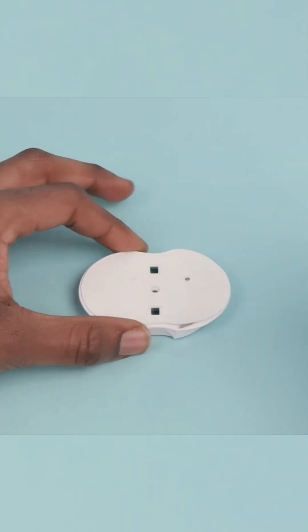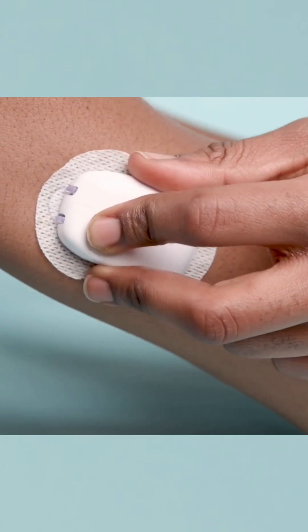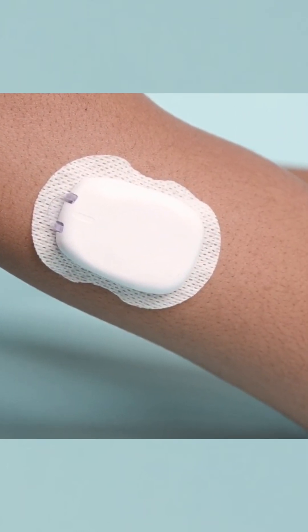When you lift it up, the adhesive is already exposed and peeled off — it's ready to go. So you lift it up and put it on. Fill. Attach. Apply. It's really simple.